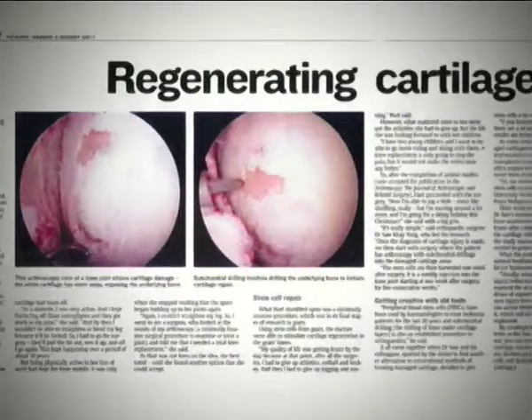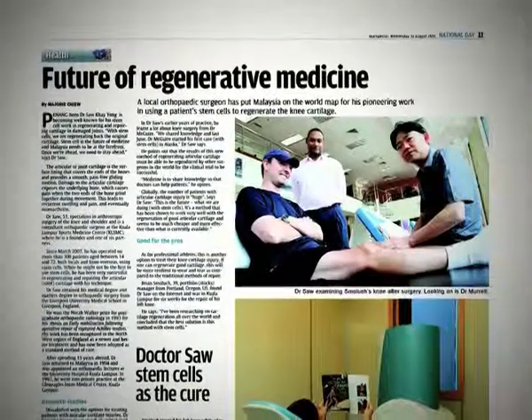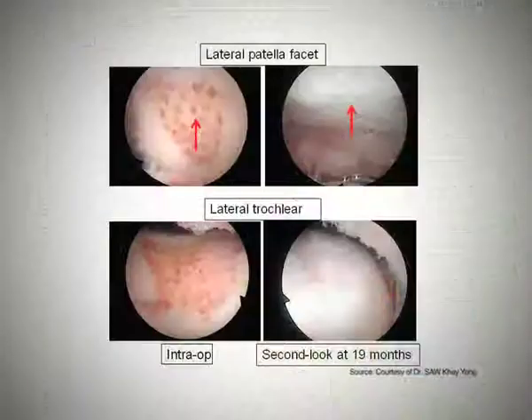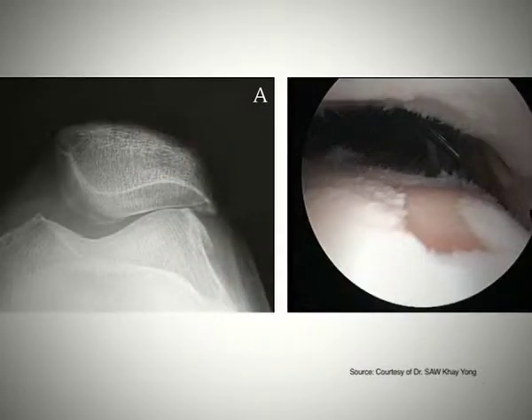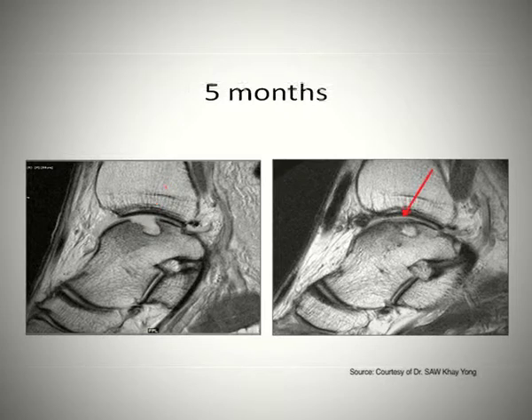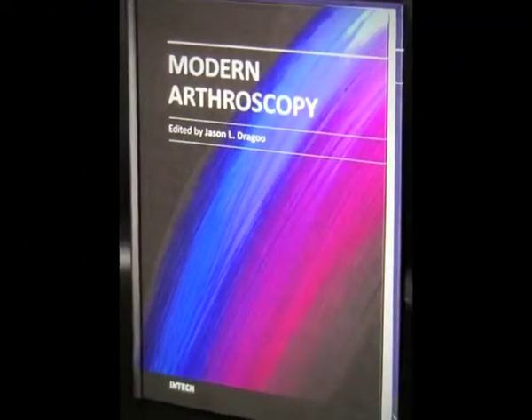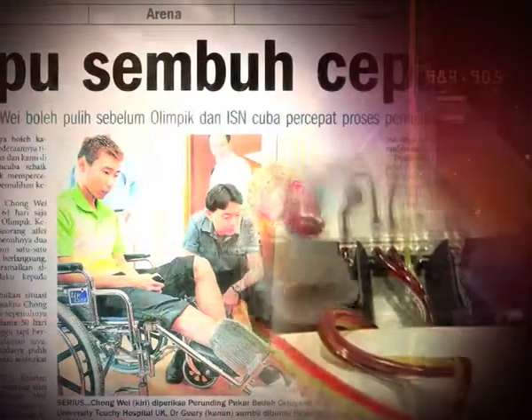Our technique in regenerating articular cartilage of the knee is simple and can be performed arthroscopically in a single procedure. It is possible to treat large defects, multiple defects, and kissing lesions of the joint. Our early results lead us to the conclusion that cell therapy will have an integral part in the future treatment of cartilage damage, as well as other potential orthopedic, surgical, and medical applications.